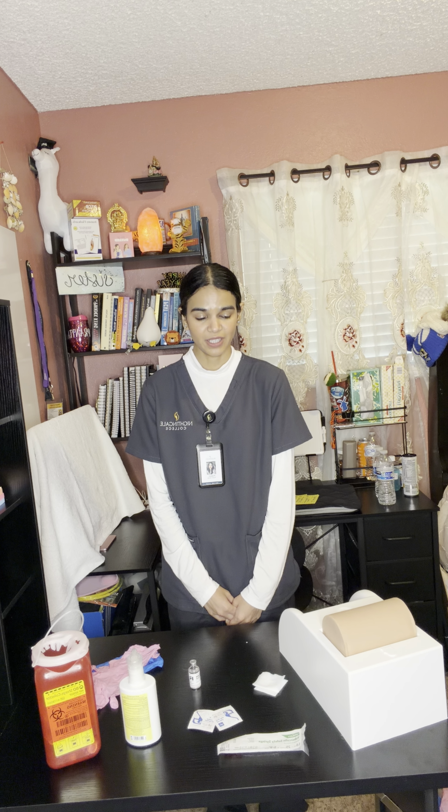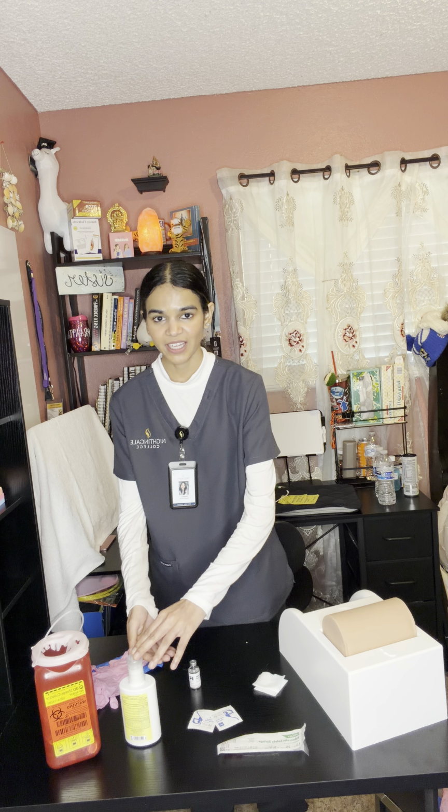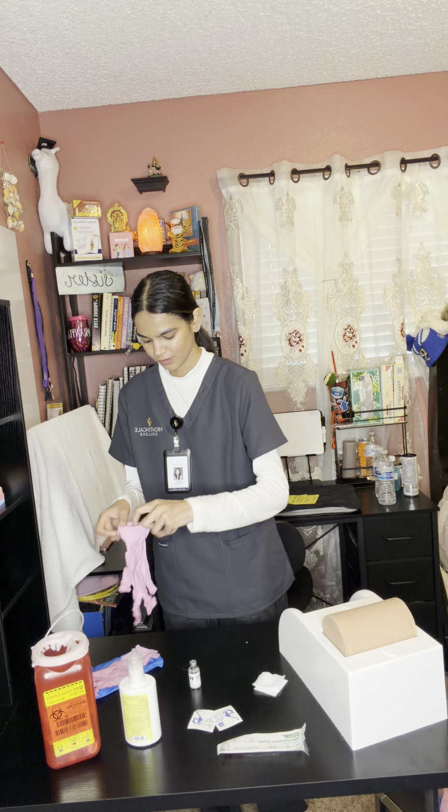Tuberculin medication does have some side effects. It can cause swelling and itchiness to the injection site. Some adverse side effects that are seen from tuberculin are hives and/or shortness of breath. With intradermal injections, it is quite common to have the common side effects of itching and swelling. Do you have any questions for me? No? Okay. Next, I will perform hand hygiene and I'll apply my gloves on.